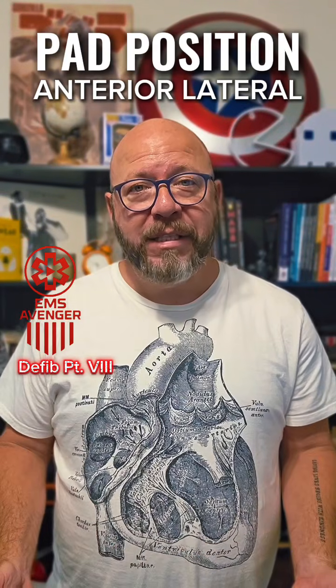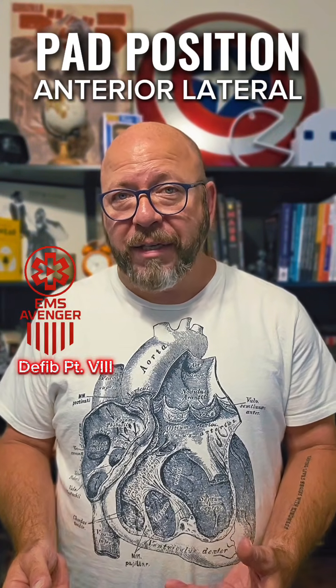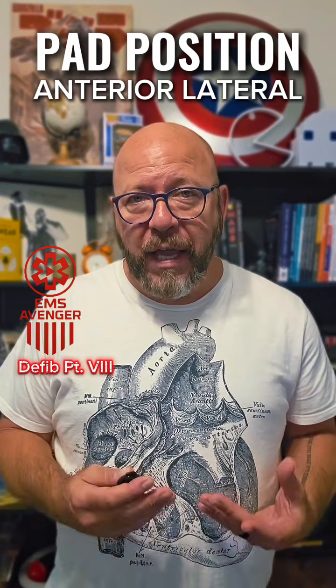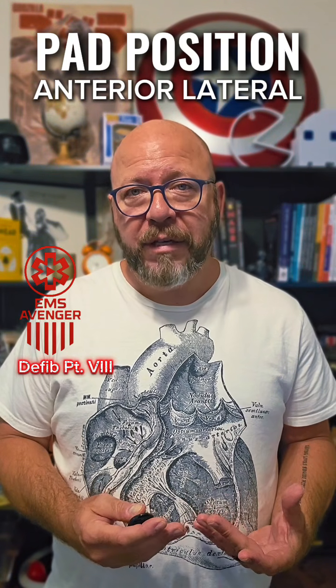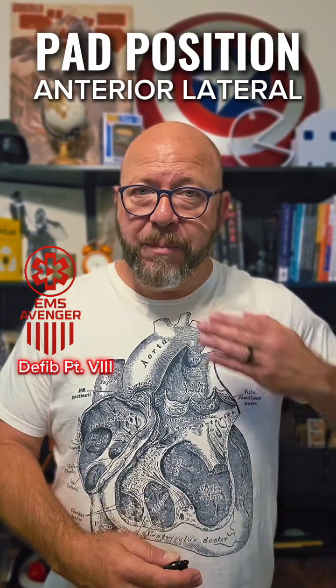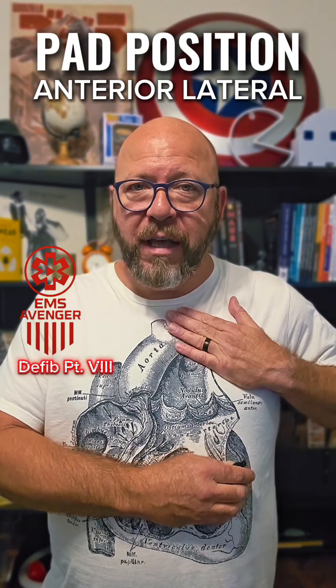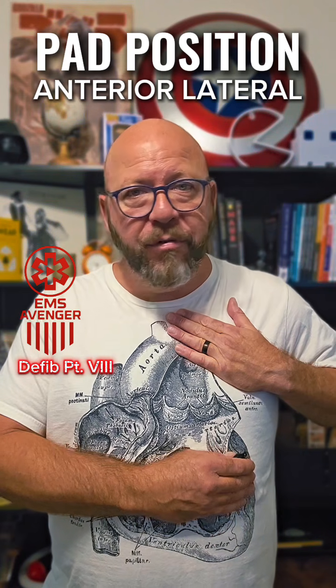Let's talk about pad placement and specifically what you're trying to accomplish with pad placement. What you're trying to do is get as much energy through the left ventricle as possible. Not to the left ventricle, but through it. Because if I put a pad here and a pad here, I might skip energy across the left ventricle, but I'm not getting energy through the left ventricle.